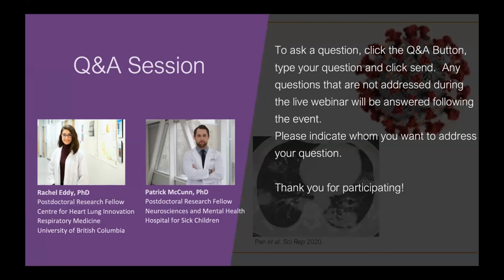As far as ultrasound, the most common application I've seen in the clinical literature is to investigate deep vein thrombosis. Pulmonary blood clots are very common, and ultrasound has been used to investigate whether those clots are forming and sticking in the lungs or whether they're coming from a deep vein thrombosis, and they are indeed not coming from deep vein thrombosis and are forming in the lungs.